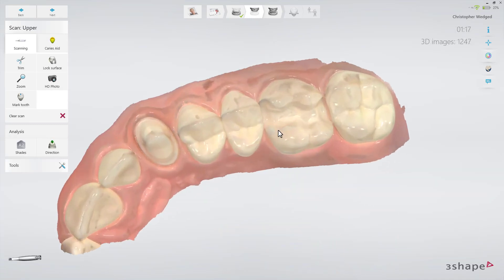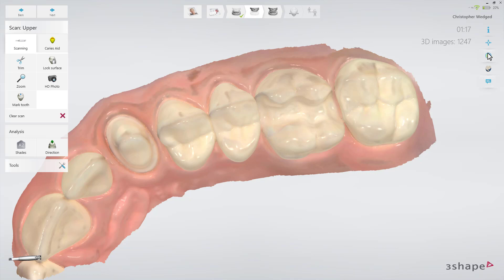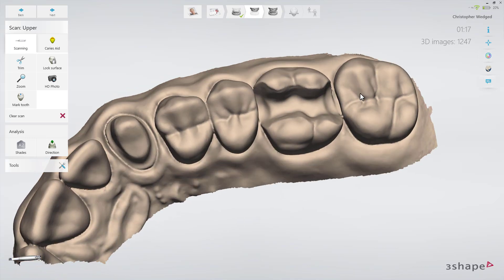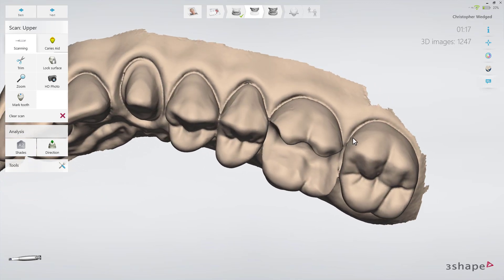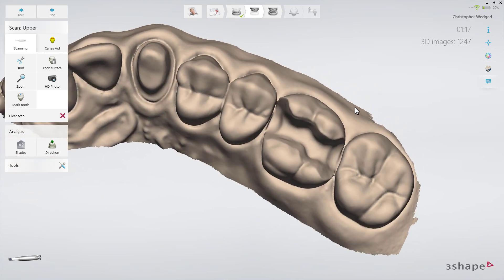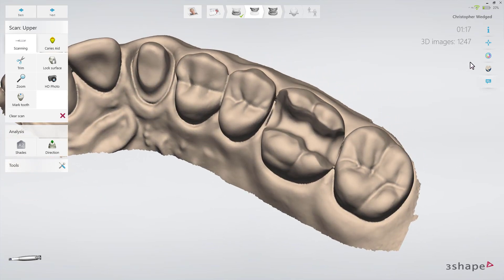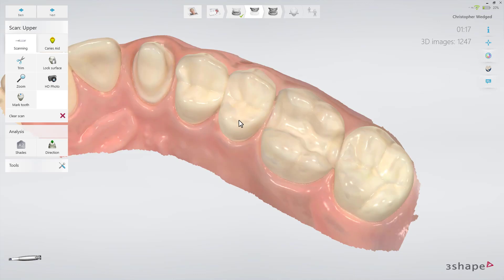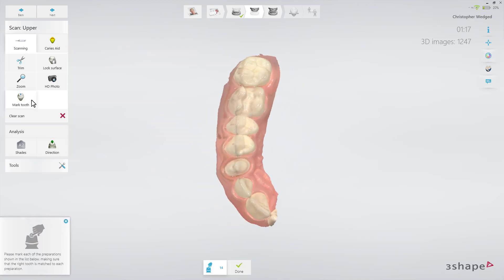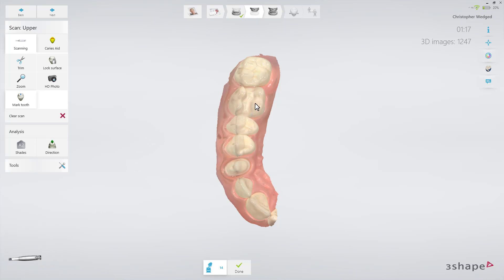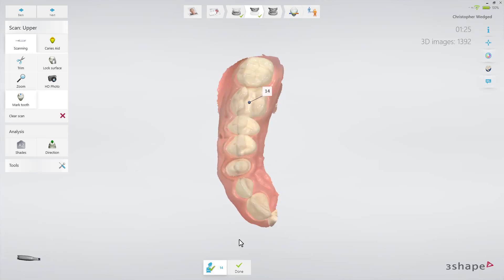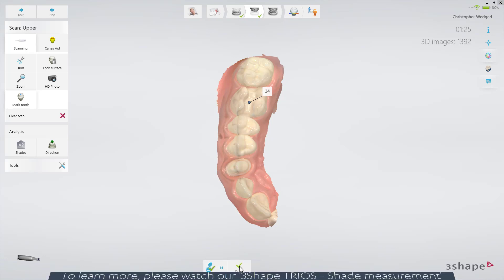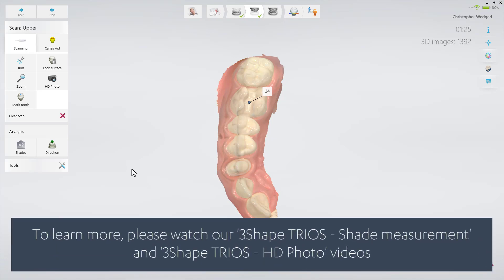Make sure that you cover the prepped area including the margin line and contact points. Do this by zooming in on the preparation. Turn off colors and rotate the preparation. Mark the preparation by clicking the center of the preparation when seen from the occlusal view. Now you have the opportunity to take a shade measurement and add an HD photo.